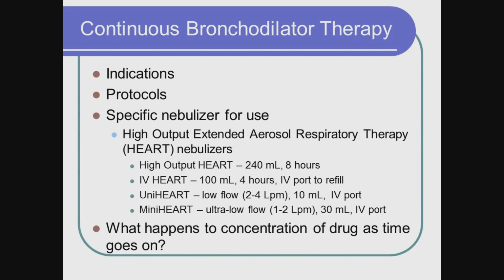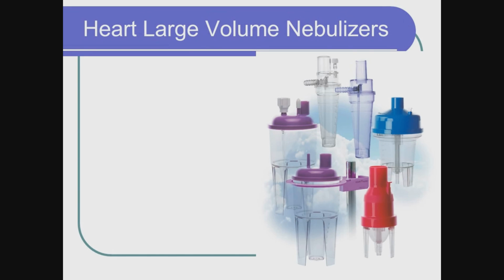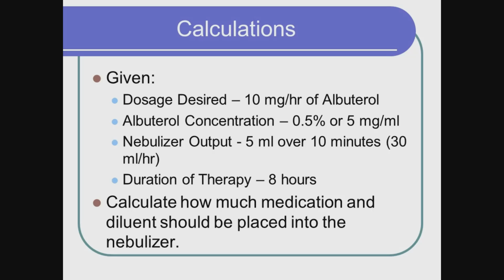What happens to the concentration of the drug as time goes on? Nothing. Stays the same. Concentration doesn't change. Here's a picture of what some of these things look like. Okay, so it maintains a flow for a long period of time.